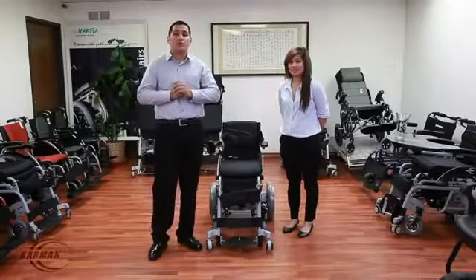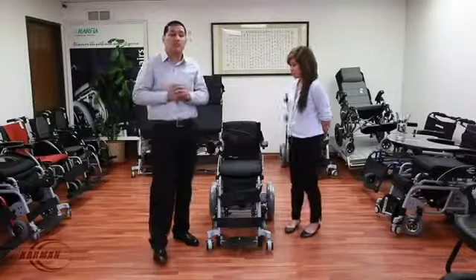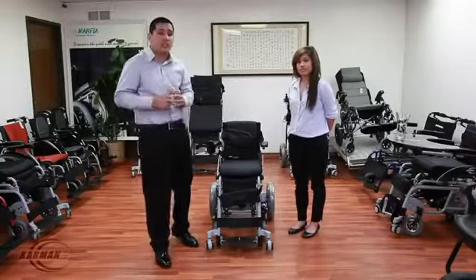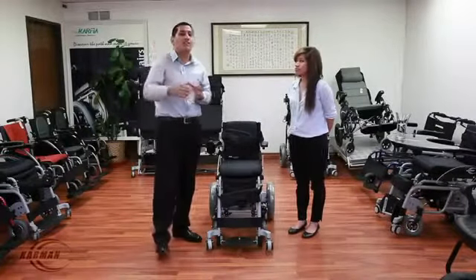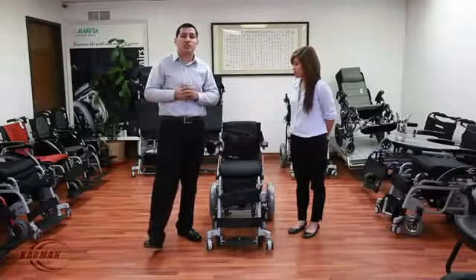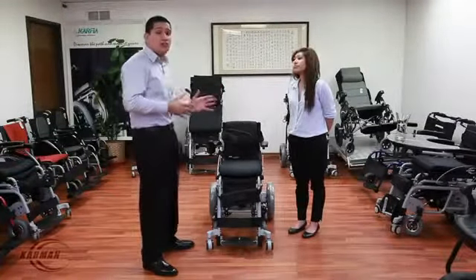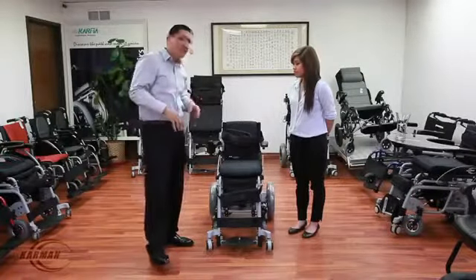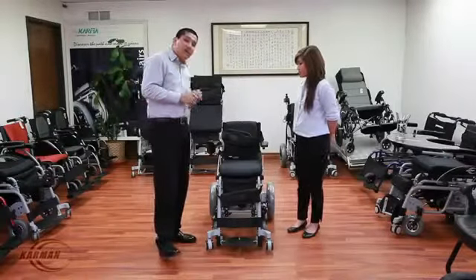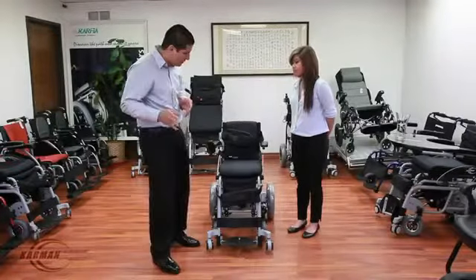This XO202 is a fully powered chair — you're able to drive and stand up. That's right folks, it's a power drive and power stand up. Unlike other stand-up models, this chair comes standard with many safety features that ensure your loved one is nice and safe and cozy. The first model we're going to start with is our XO202J, our junior model. This is a 14-inch seat width, about 18-inch seat depth, with a 250-pound maximum weight capacity.